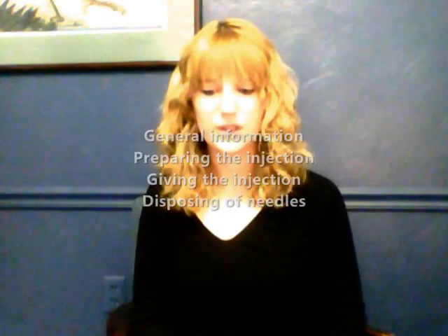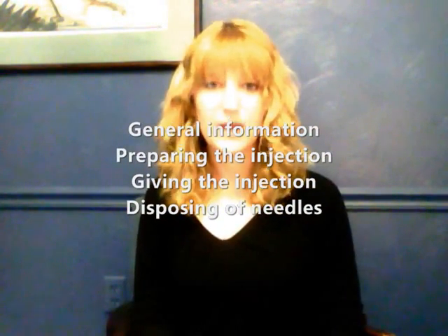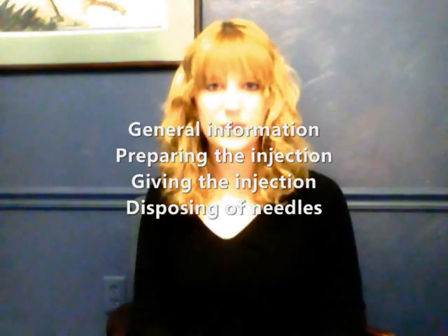Hi, I'm Marina from RC Compounding Services. Today I'm going to go over how to give yourself a hydroxyprogesterone injection. Some things we're going to cover today are general progesterone information, how to prepare an injection, how to give the injection, and how to dispose of the needles.